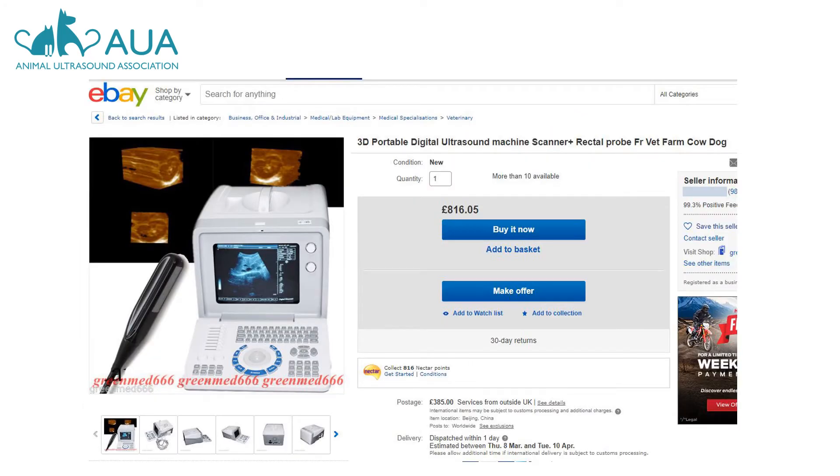Let's look at some of the choices out there on the internet right now. This machine here is a bargain at £816, with an electronic probe and even has 3D imaging. Given that high quality electronic transducers will cost around £1,000 alone, alarm bells are already ringing about the quality of this probe. But can you spot an obvious problem? Look at the style of the probe and also read the title: 'Scanner and rectal probe for vet, farm, cow, dog.'